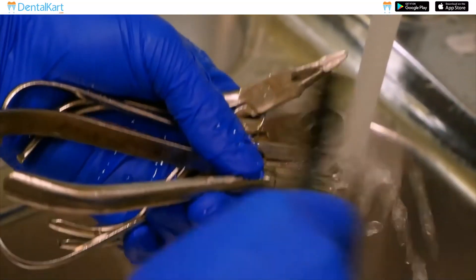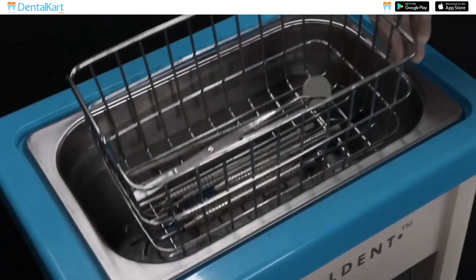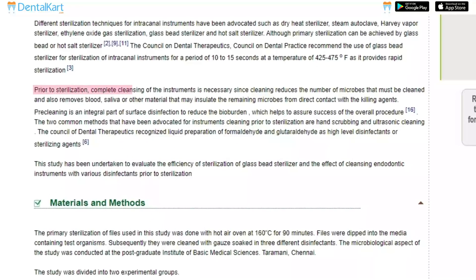Prior to sterilization, complete cleaning of the instruments by hand scrubbing or ultrasonic cleaning is necessary, since pre-cleaning is an integral part of surface disinfection to reduce the bio-burden, which helps to assure the success of the overall procedure.